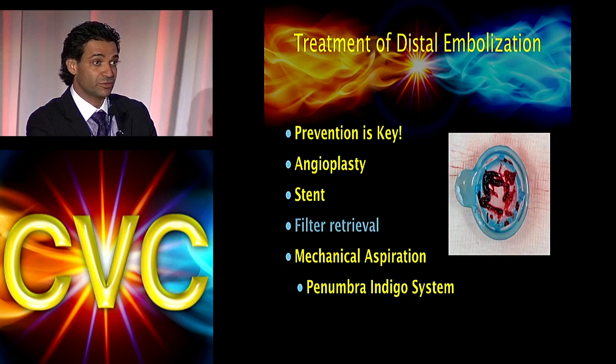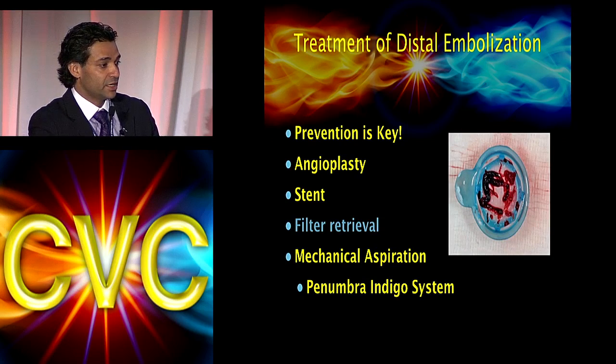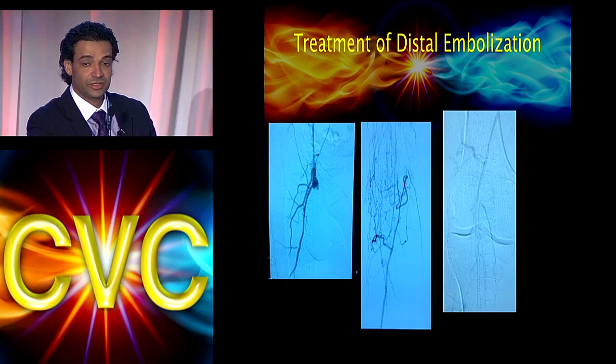You have to be very careful with the wire. You have to be very careful with the filter. Deploy the filter, catch it, and then pull it back. And you can sometimes get some pretty good success with that. This is an example of that.